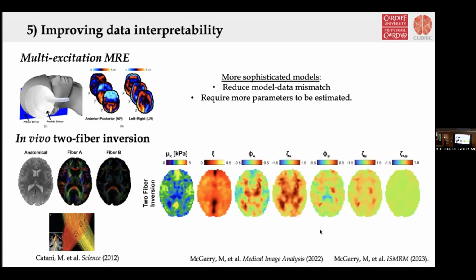It depends a bit on how local the inversion problem is that you have to solve. What we saw in conductivity phantoms for our MRCDI is that they're actually not very useful because they are too simplified in the geometry. So they fit quite nicely, but then the inversion algorithms don't work out.